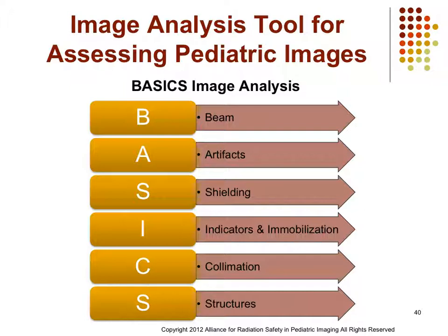We're shielding our patients effectively, so think every patient needs a shield, regardless of their age. Somewhere on the body can be shielded, so it's not just about the gonads, but breasts are actually considered to be the most sensitive structure, but there's plenty of other radiosensitive structures that we can also shield when it's not possible to shield the gonads.